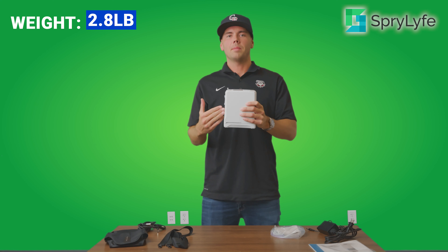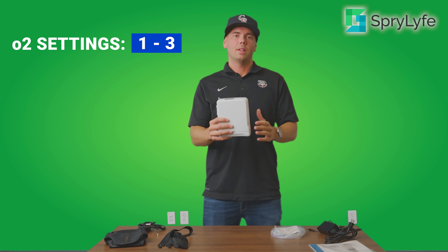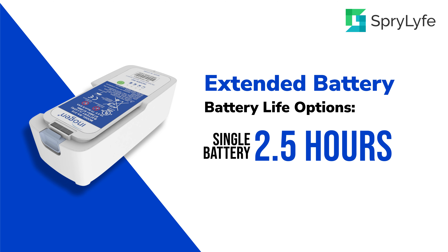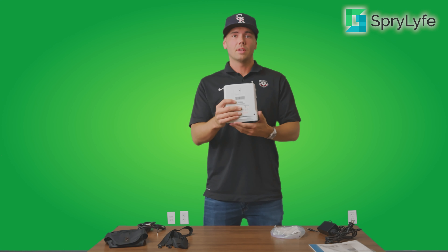The flow settings go from a setting of one to three. The battery life — which is pretty important — with the four-cell battery attached right here, the battery life is about two and a half hours on a setting of two. If you opt for the double battery, also known as the eight-cell battery, that battery life is up to four and a half hours — essentially double, which is why they call it the double battery.